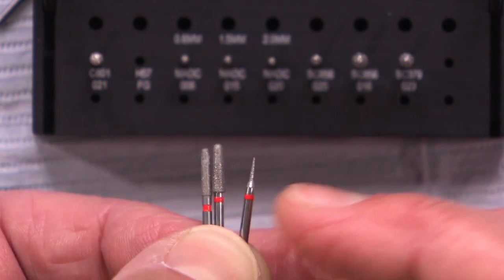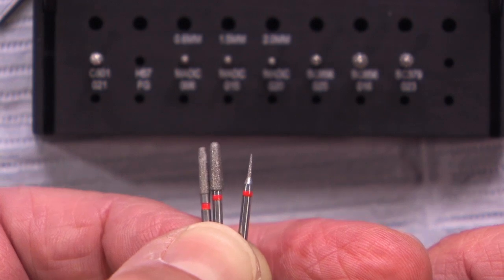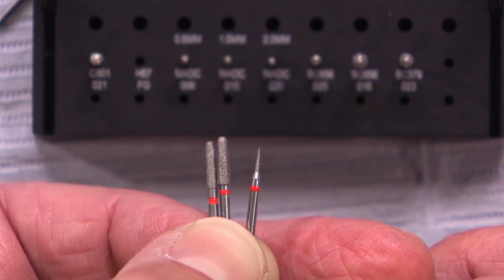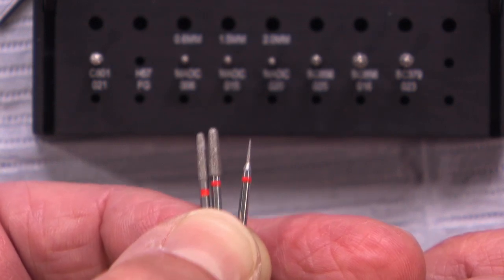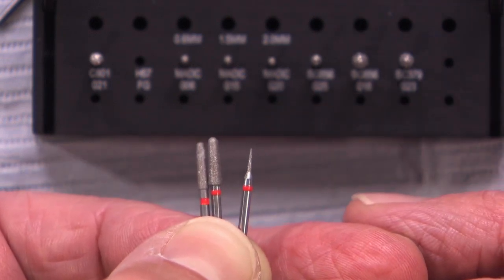That's why I'll go in with this fine grit burr and recontour in between and create some separation between those two teeth, because we're going to need to get a saw blade in there, obviously, to be able to section that die out of there. So anytime you have two teeth contacting each other in the gingival third, because of root proximity or whatever it might be, this 392016 does a great job of separating those two teeth.